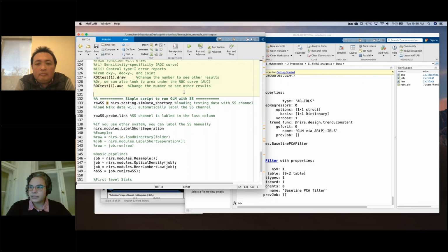You already shared the online data set for this paper, I guess. Is there a difference between the short distance at 10 Hertz compared to 1 Hertz, for example? Would the sampling rate make any difference from the short channel perspective? I think yes, but I don't know how to compare that, because from the NIRx we have 10 Hertz by default, and after that we always resample to 4 Hertz.